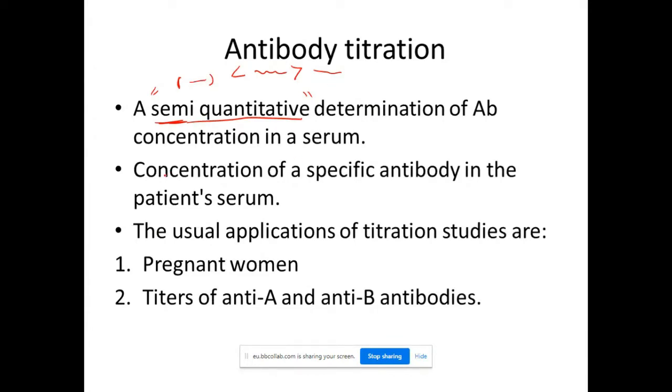Antibody titration helps me know the concentration of a specific antibody in the patient's serum, to know if the antibody titer is low or high.